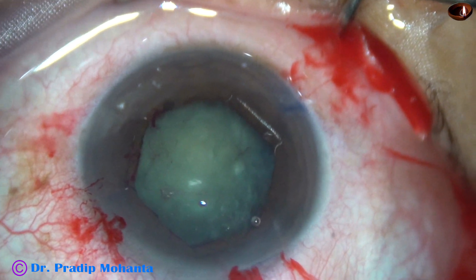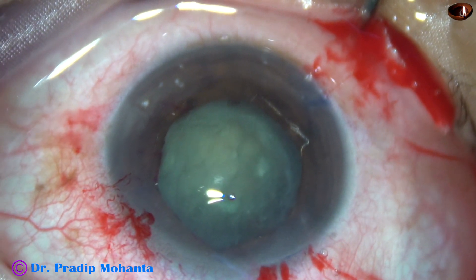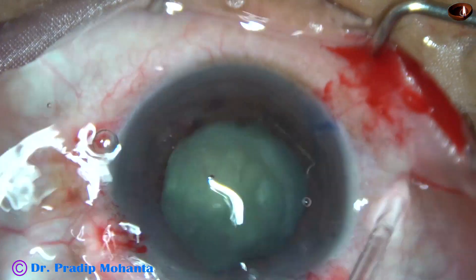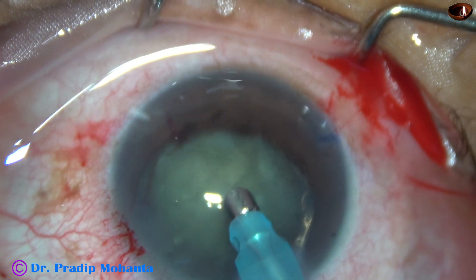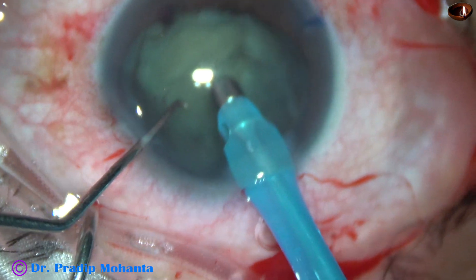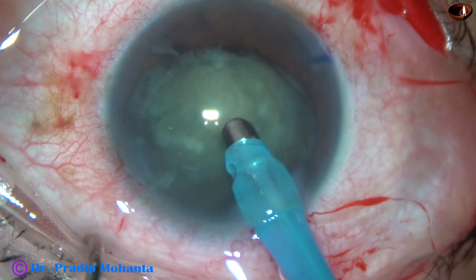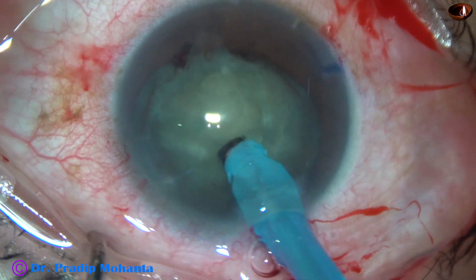The nucleus rotated nicely. And now some more viscoelastic is injected to fill up the anterior chamber. And now this is the phaco cone — see what happens. By the irrigation, there was reverse pupillary block. The pupil dilated to almost 7 millimeters and the Bhex just came off.